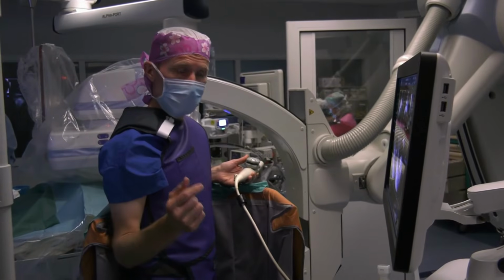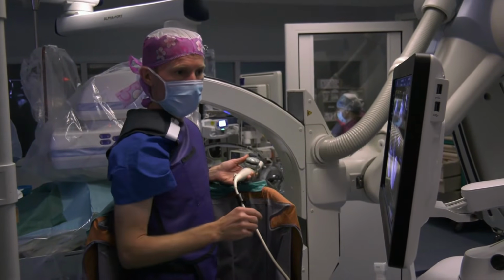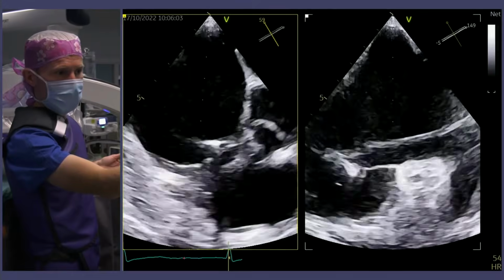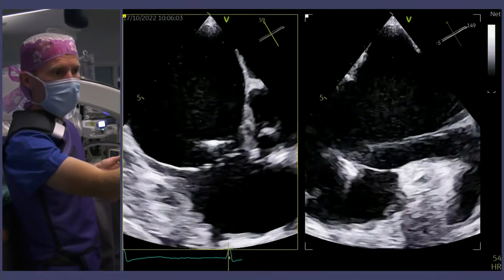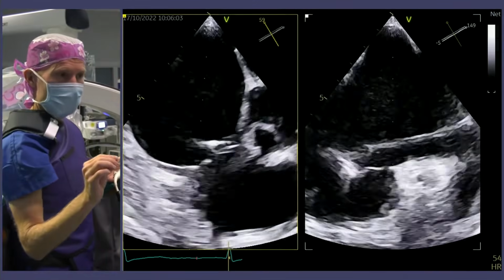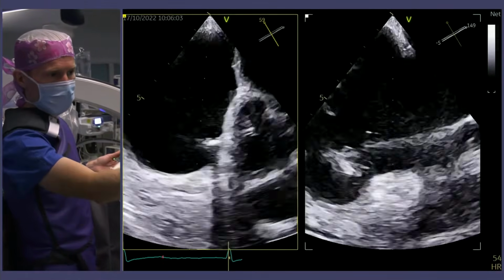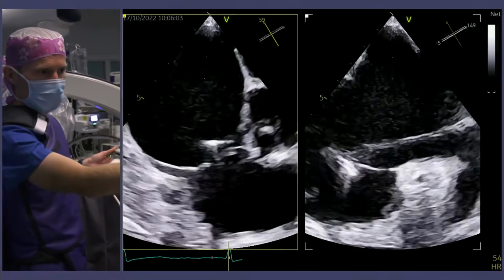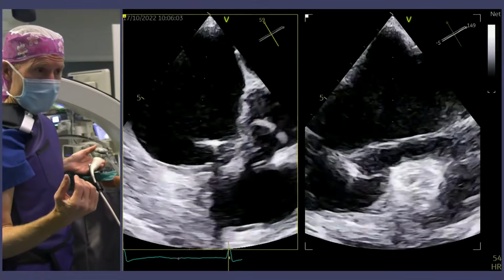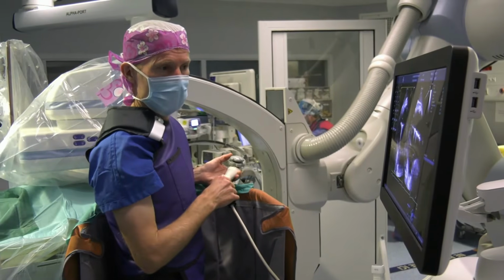To cross the valve, they close the arms of the clip, and then you will see in this transgastric view and the biplane mode that they cross the valve in the middle, as you can see now. So you see the clip in the middle of the tricuspid valve, and then we will move very slowly, very carefully the clip to go in front of the mid part of the septal leaflet and the mid part of the anterior leaflet. So it will be done using the transgastric view, and then when we want to grasp the leaflets, we will go back to the transesophageal view.